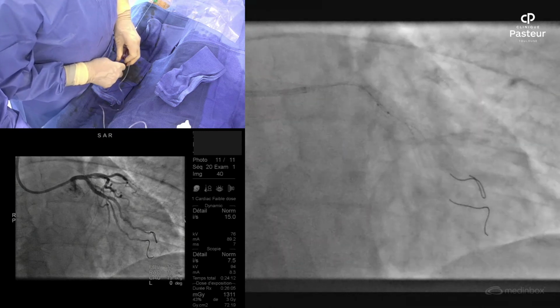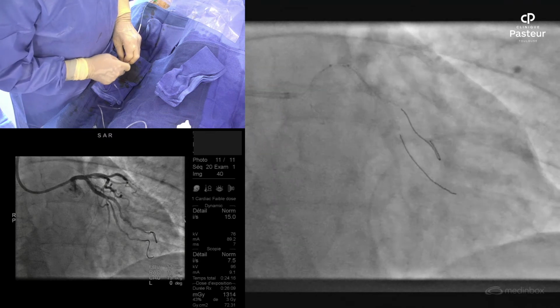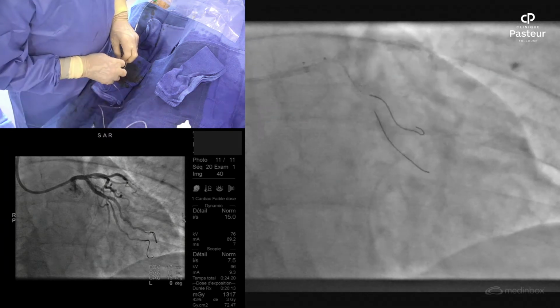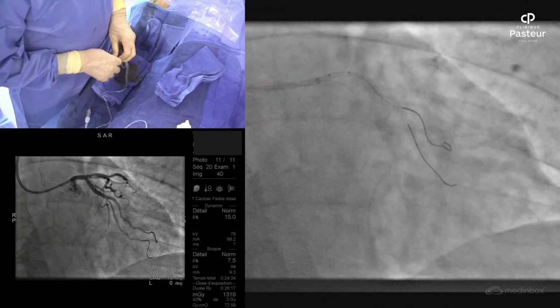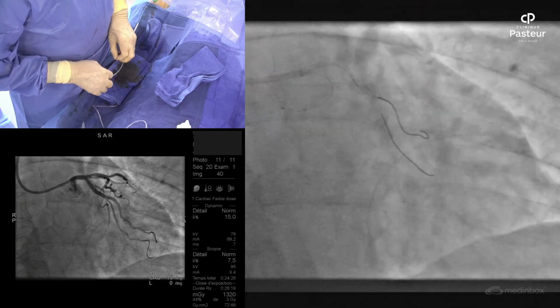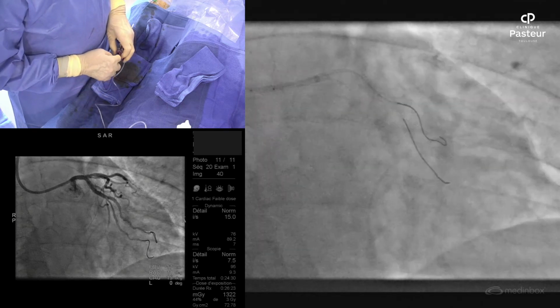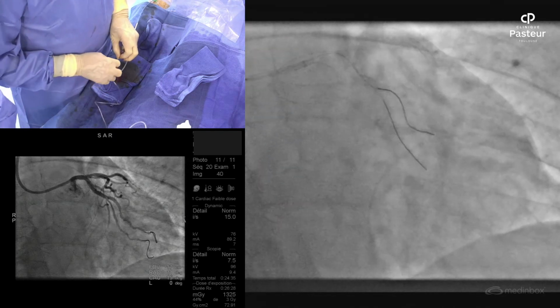Difficult. Sorry. You are on which wire? Is this one? But you see, oh my God, I have a loop. Yeah. But the problem is, is the balloon on this wire? Yes. So difficult. So if not, I will remove everything.